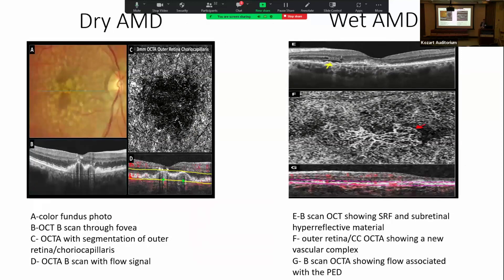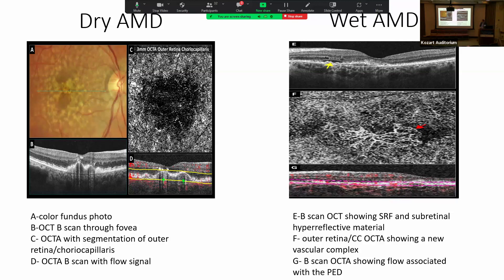Let's talk about another really important clinical application: looking at dry versus wet macular degeneration. The patient on the left has just the dry form — color fundus photo labeled A shows drusen, with OCT B-scan showing drusenoid PEDs. When you look at the OCTA, segment C corresponding to the choriocapillaris does not show a vascular complex, and D on the B-scan shows no flow. Contrast that with the patient with wet AMD who has a trace sliver of subretinal fluid as depicted by the yellow arrow, and a clear choroidal neovascular complex in F — the segmented layer for choroidal vascular networks — with clearly visible flow within those networks on image G.